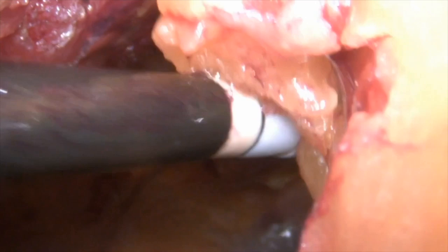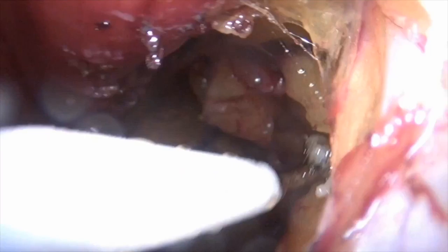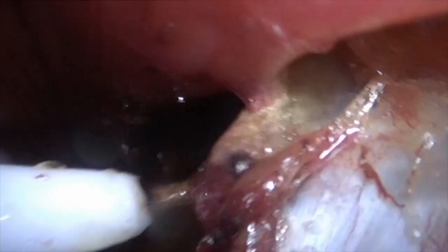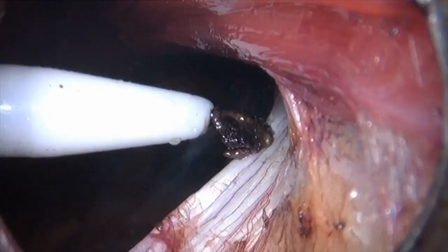And in e-TEP, there is not too much dissection which is unnecessary, except 3 to 4 centimeters of the retrorectus space. But that definitely is not too harmful, and it's not going to add to the morbidity of the patient as well. So during the initial curves of TEP repair, e-TEP definitely makes your life much easier.